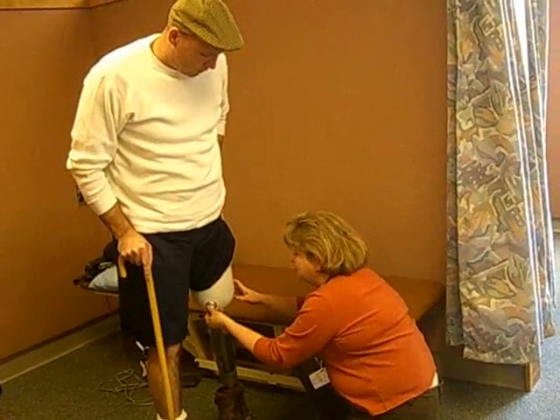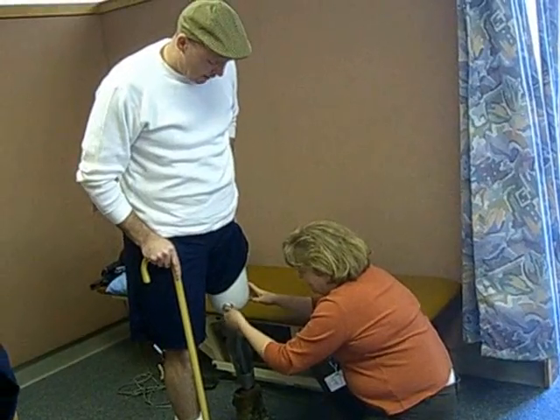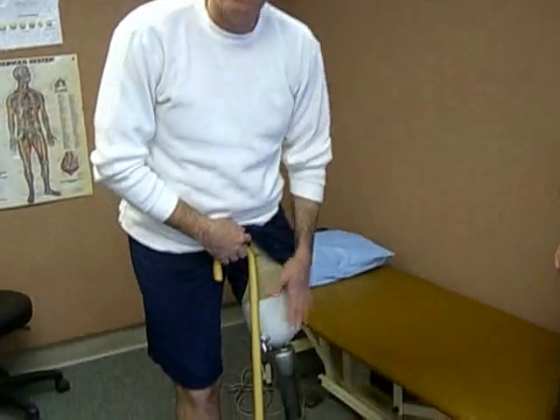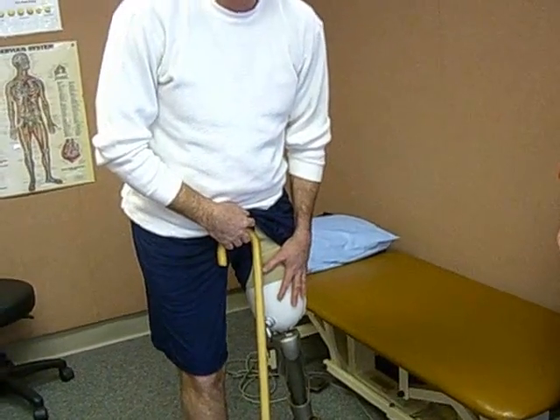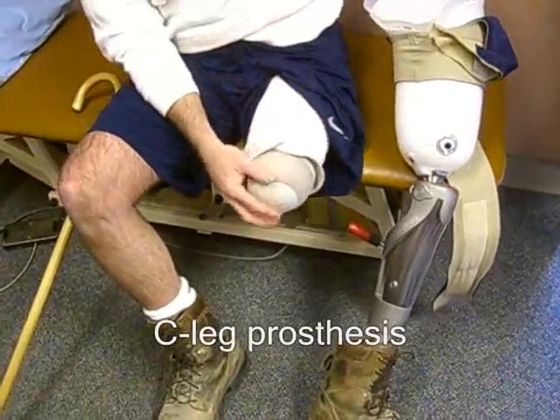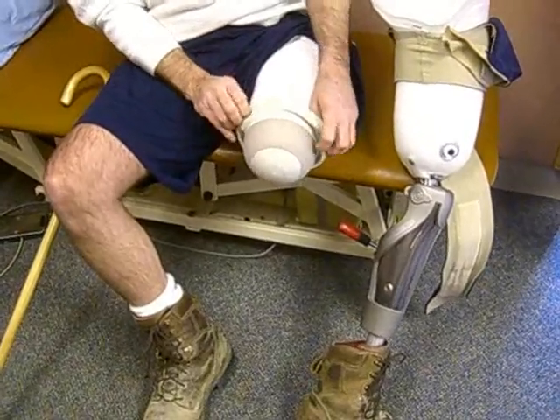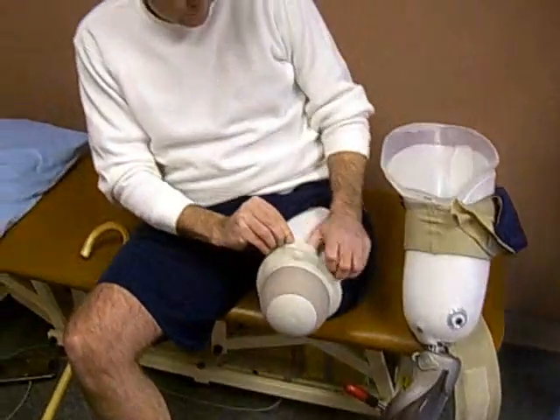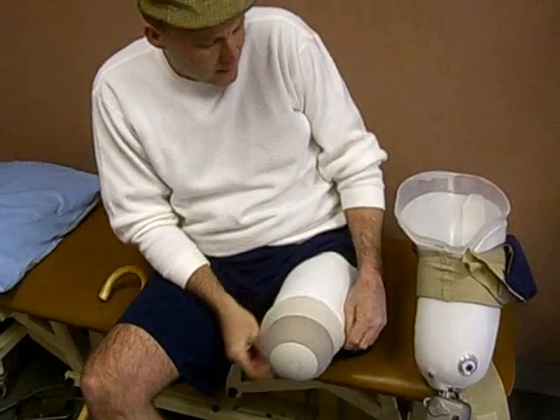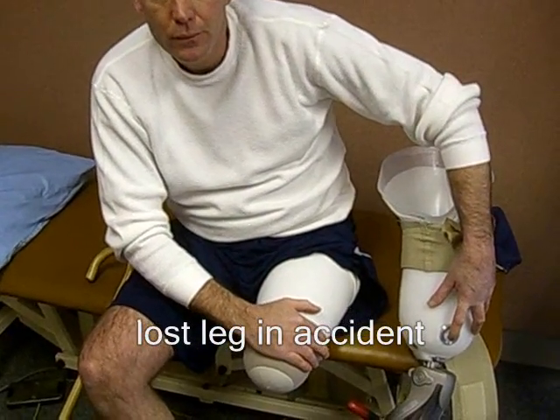This feels the most comfortable, but it feels like the toe is kicking. Getting this part right here is your main goal, getting your fitting right. And this is what's known as a gel liner. As this sits in here, you let the air out and this kind of holds it in. Do you have any discomfort?